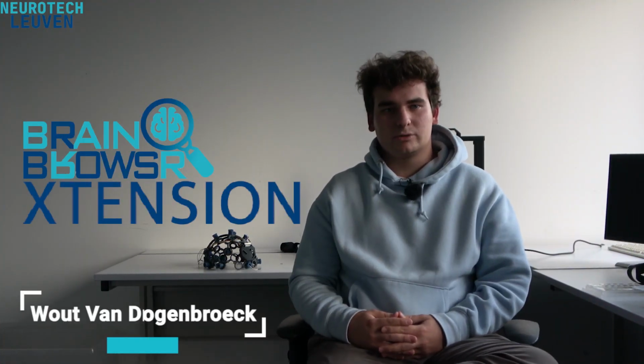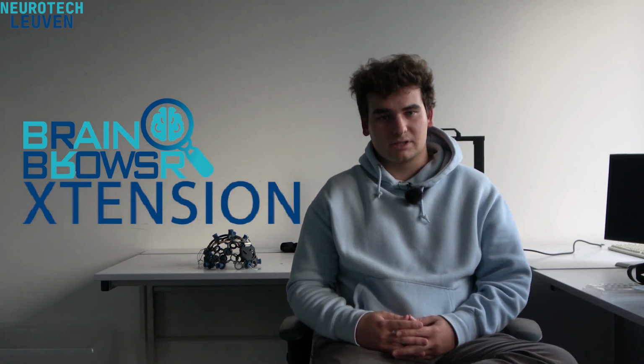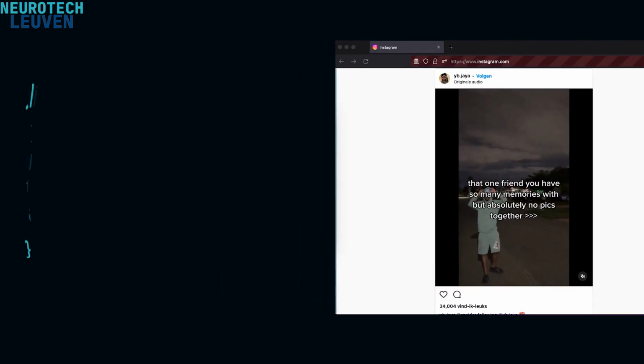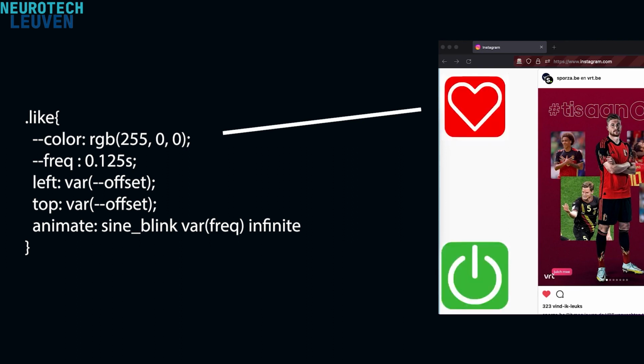At the core of BrainBrowsR is Xtension, a browser extension that inserts periodically flickering stimuli into the web page using JavaScript. Because we use HTML elements and stimuli, they can be easily animated via CSS, which gives developers a lot of opportunities for web-based brain-computer interactions.